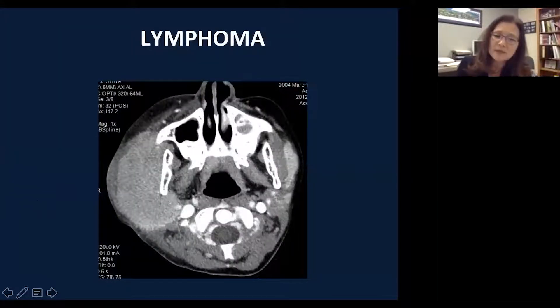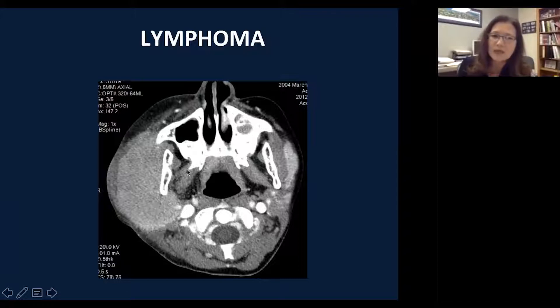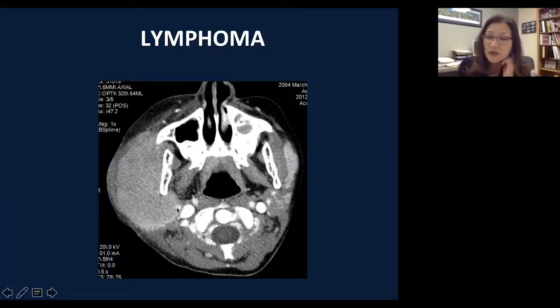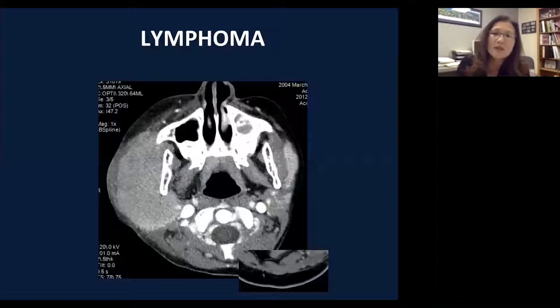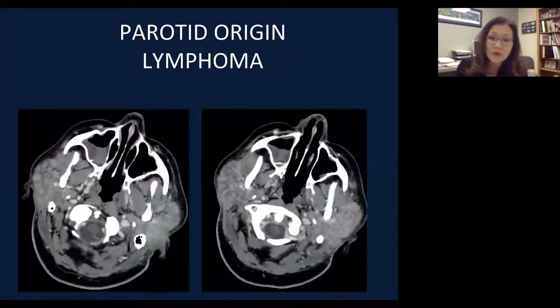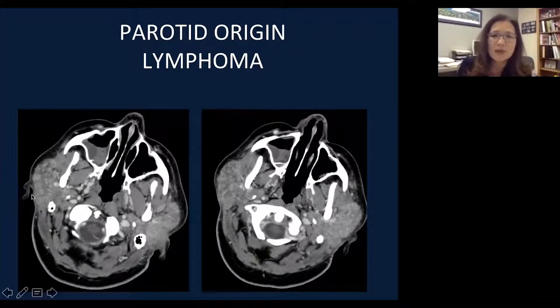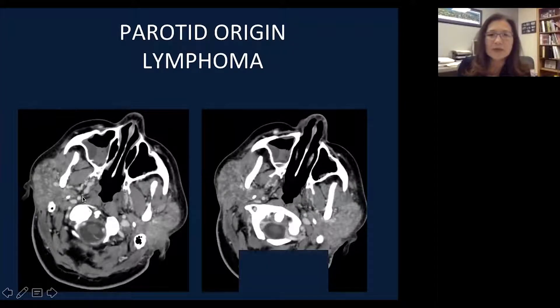Lymphoma tends to present with quite diffuse findings. This is a primary parotid lymphoma with huge diffuse enlargement of the parotid lobe, without aggressive bone destruction despite the large tumor size — similar to lymphoma seen elsewhere in the body. Lymphoma can be bilateral, although much more commonly unilateral. This is a case of bilateral primary parotid lymphoma.